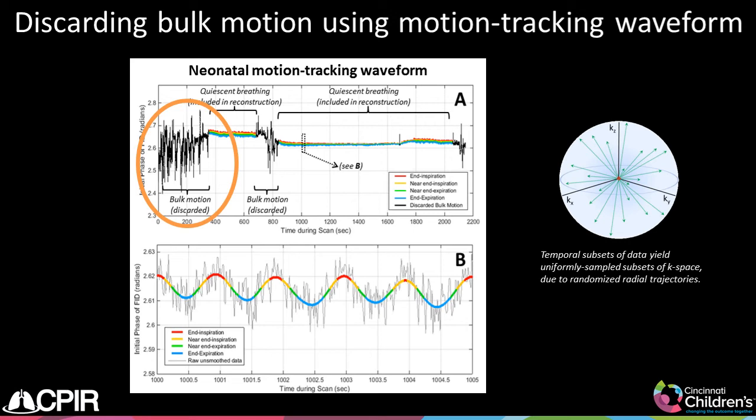We cannot ask an infant to simply sit still through an MRI scan, and as you can see from this neonatal motion tracking waveform, these infants often decide to wiggle in the bore as they please.